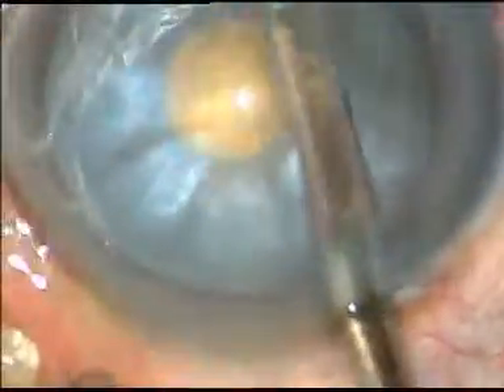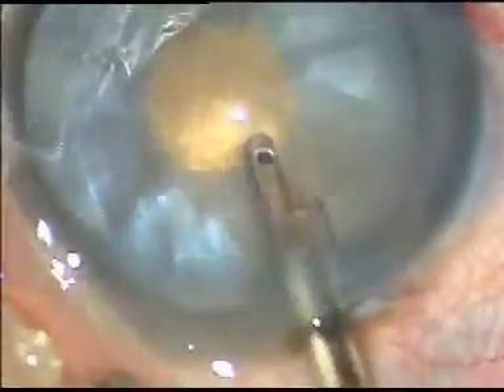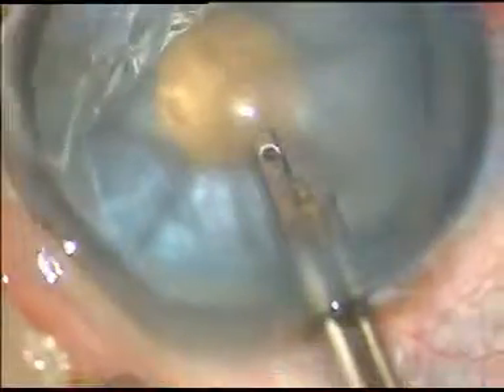Now, some superficial lens matter — some cortical fibers — are aspirated with the help of any instrument. In this case, it is a direct simco cannula. You can use bimanual irrigation aspiration also.